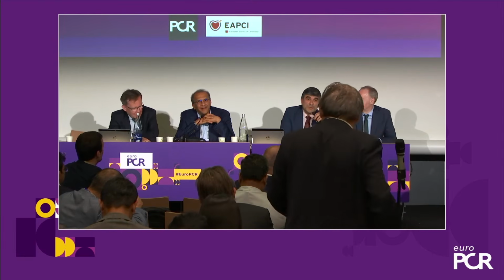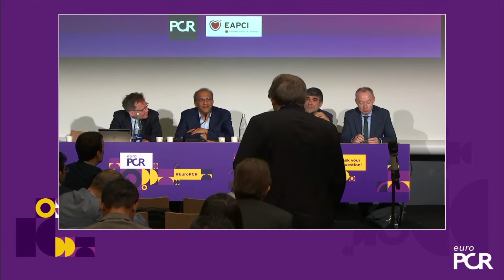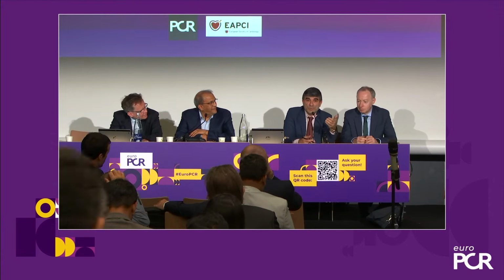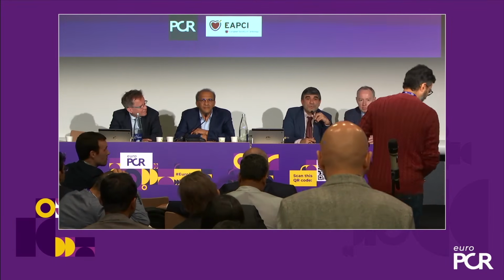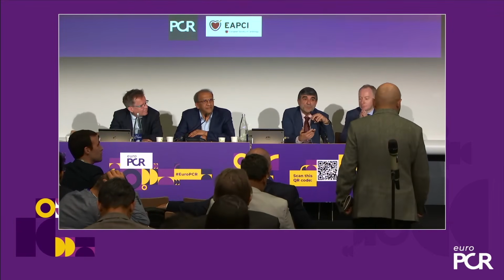Well, thank you. That's quite a clinical experience that shows you. And this is the message we're trying to send out. Not everybody has laser, but if you understand how it works and the efficacy of it, it really bails you out. How many of you have had this scenario where you put the wire down and you tried a microcatheter, small balloon, and to deliver rotablation, whatever you want to do, and you're not successful? Show me your hand, please. That's right. Exactly. So this is where you have to be thinking about what else can I do, and this is where this comes in.